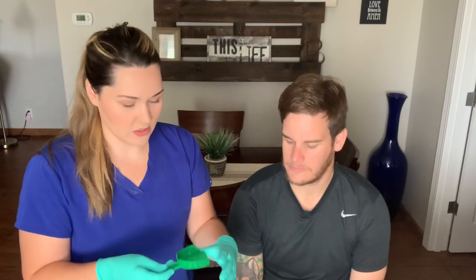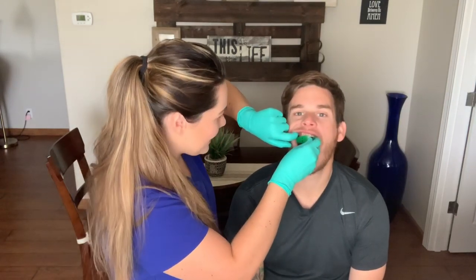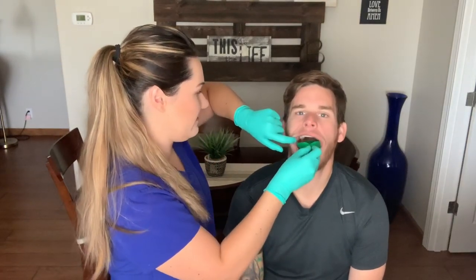The very first thing you want to do is try in which tray is going to fit your patient. I already know my husband has a rather large mouth, but you're not going to know that until you try the trays in. You always basically want to start with the medium tray — a lot of people are not going to need the small tray, but most people are going to be medium or large.